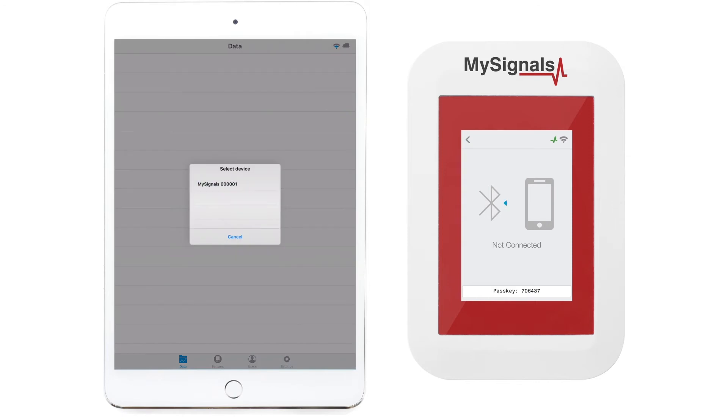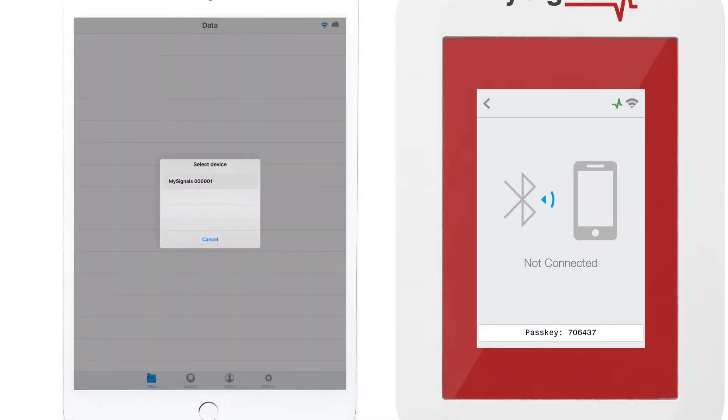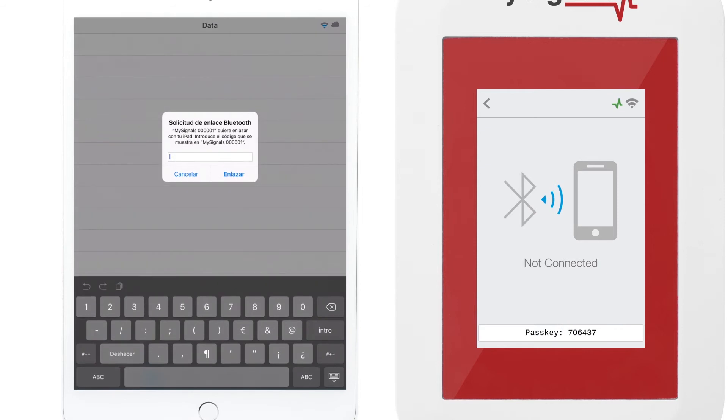After that, MySignals shows a passkey on the device screen. Write the passkey in the Bluetooth pairing request in the appearing pop-up.